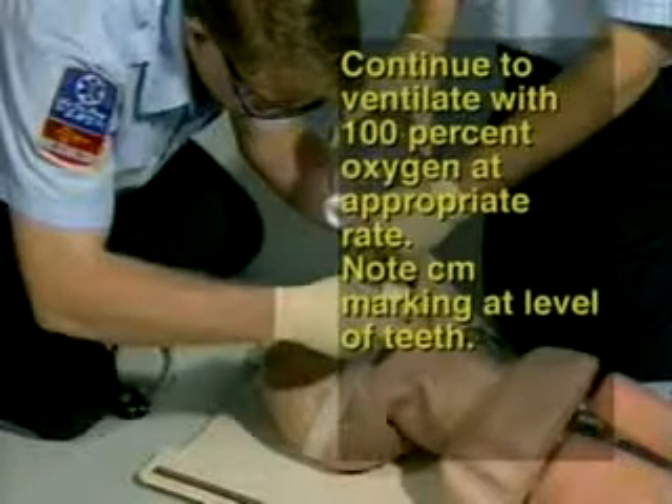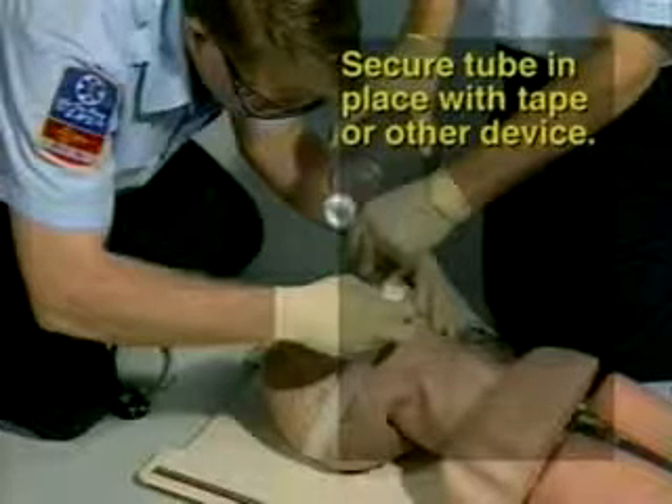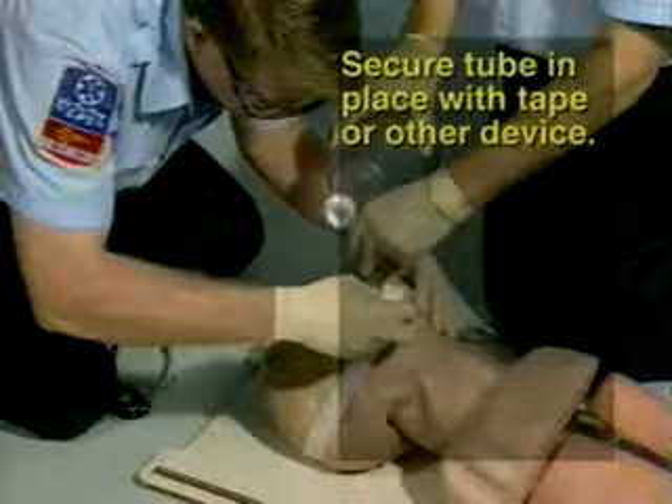Continue to ventilate with 100% oxygen at the appropriate rate. Step 19: Note the centimeter marking at the level of the teeth. Step 20: Secure the tube in place with tape or other device.